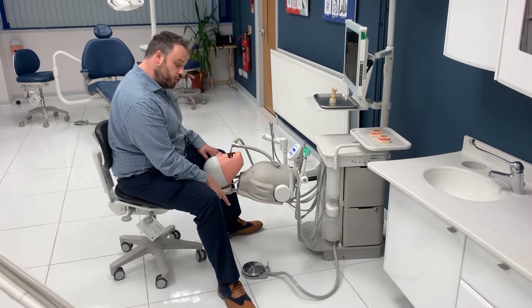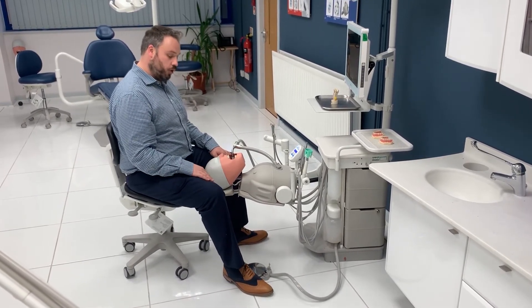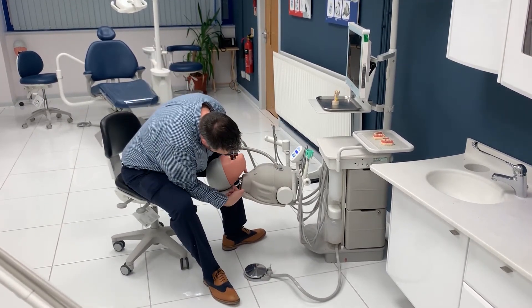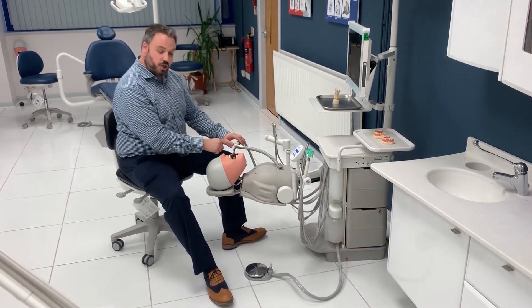For your foot control, you have two toggles. The black toggle with a yellow dot turns your suction on and off. Press the black toggle and you'll hear the suction come on. This will produce the suction at the back of the head here, and also from your suction arm there.